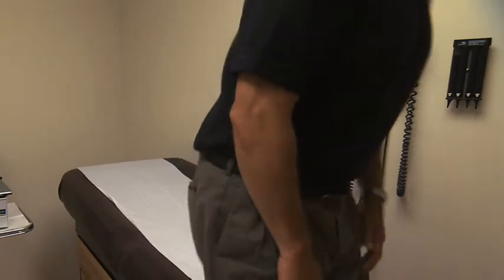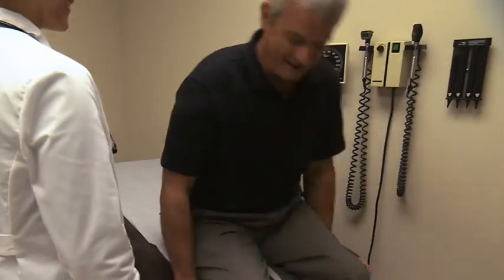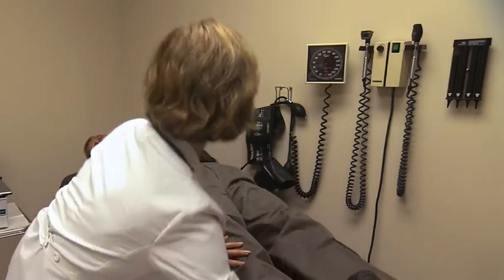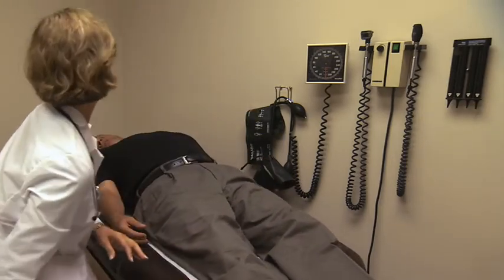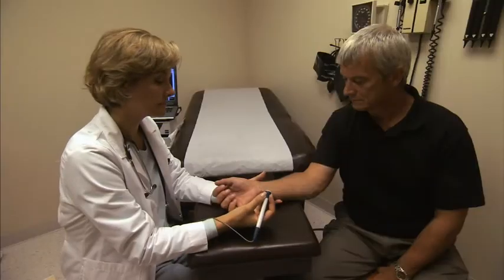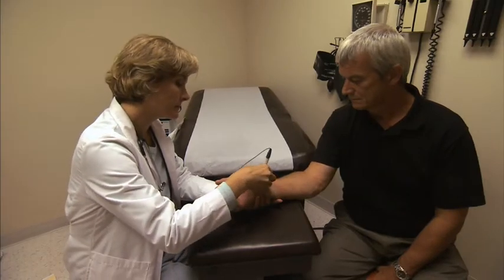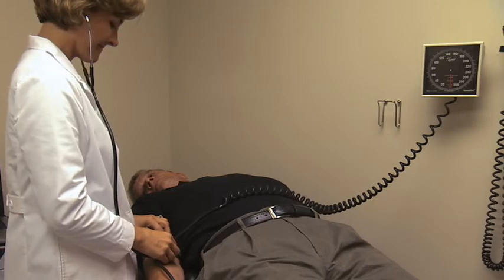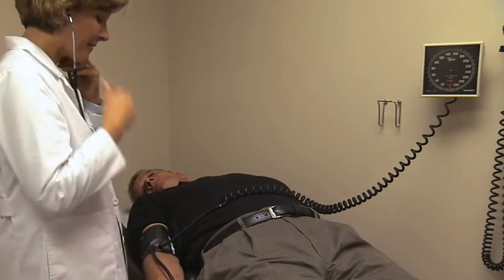Before performing a pulse wave analysis, make sure that you and your subject are in comfortable positions and that the surface that you use to support the subject's arm is completely stable. Assessments may either be performed with the patient seated or supine. The patient should be in the same position for brachial blood pressure and SphygmoCor testing.